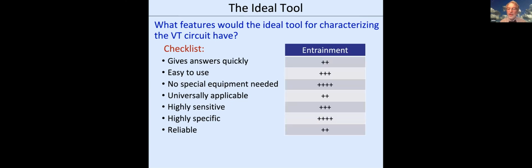very sensitive, very specific, and very reliable. There's no asterisk that says, yes, but you didn't do this right. So how does entrainment stack up with this? Well, it gives you your answers reasonably quickly if you are pretty careful about where you do the entrainment. You don't want to do it just anywhere in the ventricle. You want to focus in on a spot that looks pretty good, and it can give you an answer pretty quickly. It's pretty easy to use, not perfect.